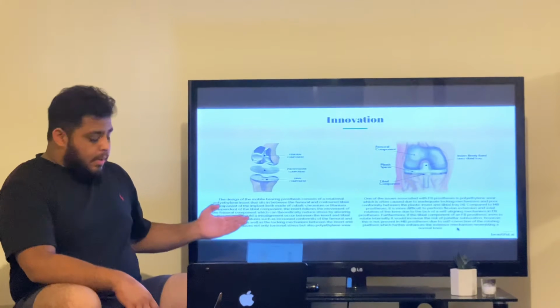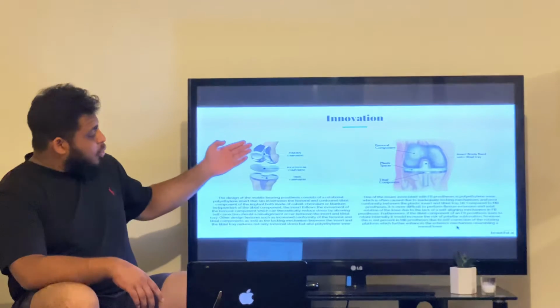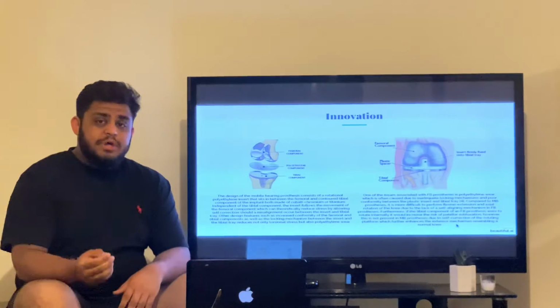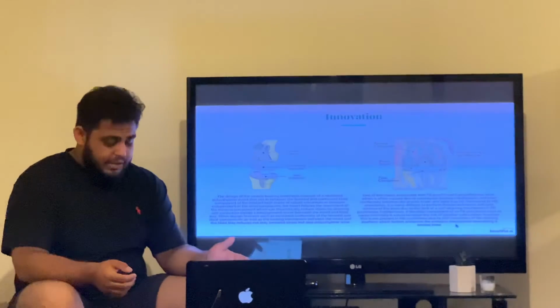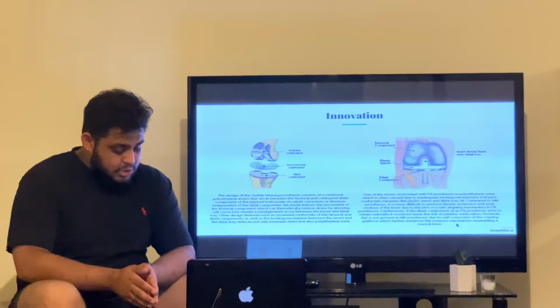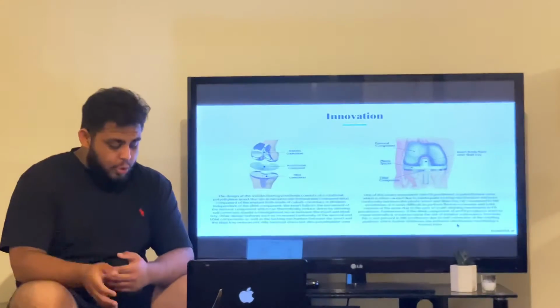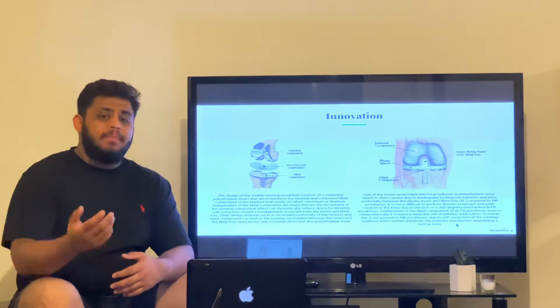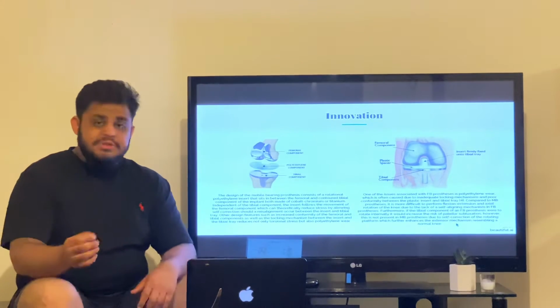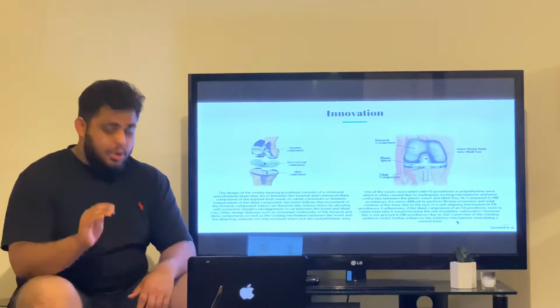The design of the mobile bearing prosthesis consists of a rotational polyethylene sheet which sits between the femoral and the tibial component of the knee, both of which are made of cobalt, chromium, or titanium. This design reduces the stress on the knee by self-correction if misalignment occurs. The femoral and tibial components also have a locking mechanism. Now, this locking mechanism sits between the insert and the tibial tray, which not only reduces stress, but also reduces the polyethylene wear.